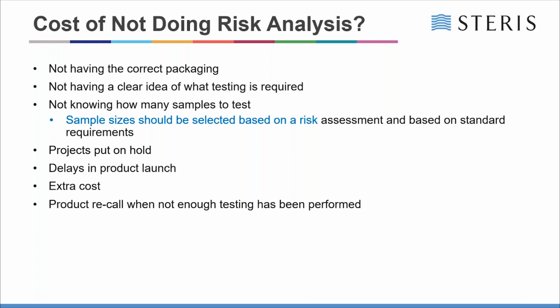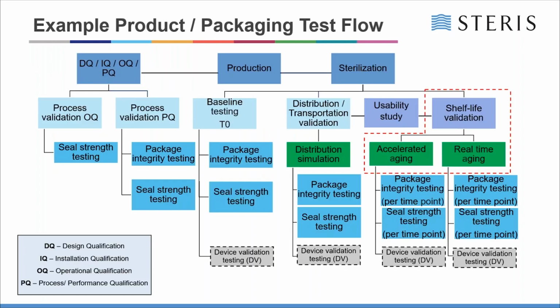Again, you can have product put on hold, delays in launch of a product, or worst case, where a product is recalled, where your regulatory body has defined that there hasn't been enough testing performed or enough samples tested to justify inclusion in their system.